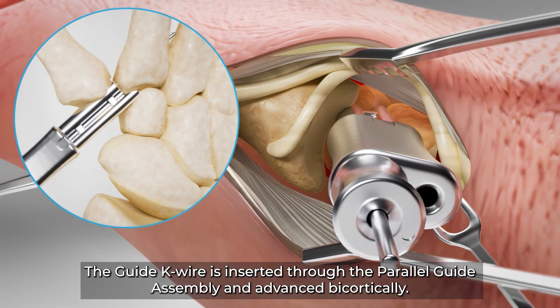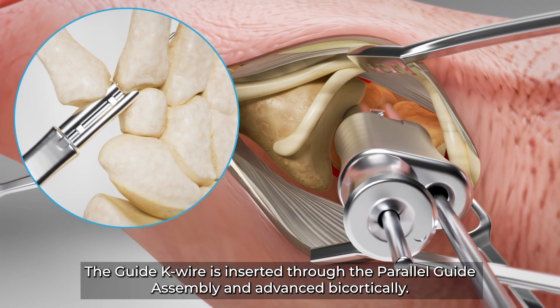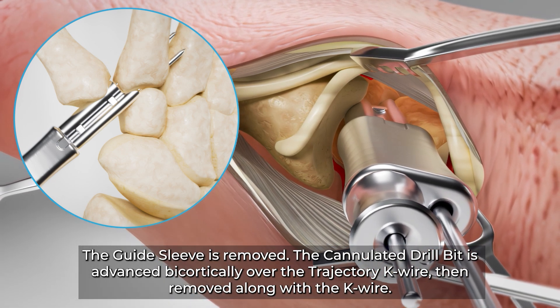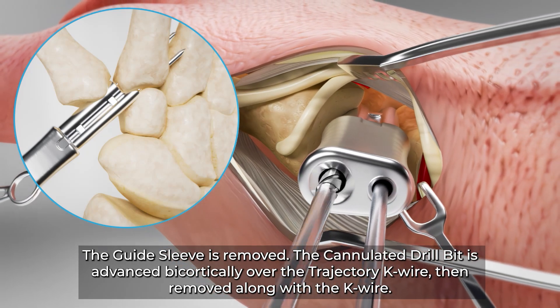The guide K wire is inserted through the parallel guide assembly and advanced bicortically. The K wire guide sleeve is removed. The cannulated drill bit is advanced bicortically over the trajectory K wire, then removed along with the K wire.